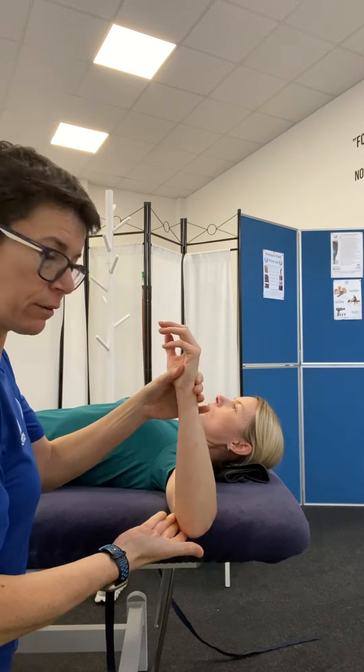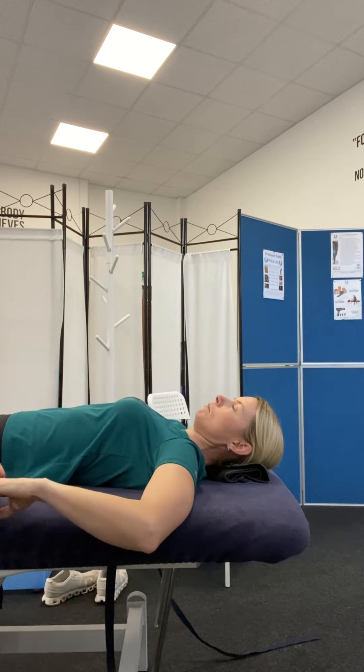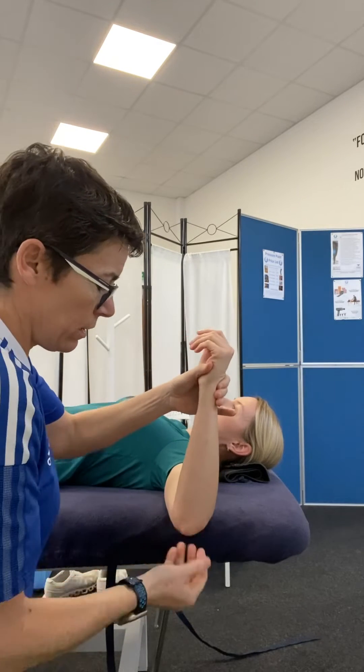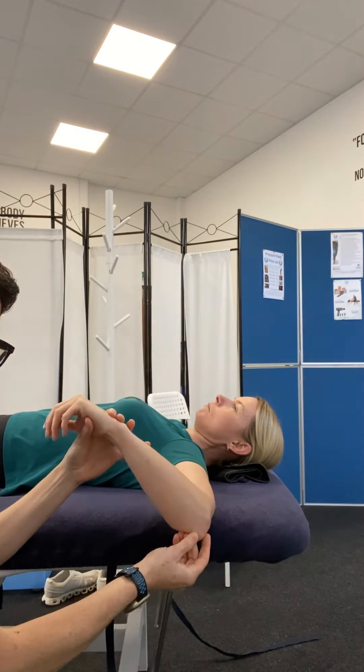If I just let the client drop into that medial rotation, you'll find that they probably come out of all the angles and therefore their shoulder looks more flexible than it actually is. So from here, I just use the olecranon process as a bit of a guide and let them drop forward from that position.